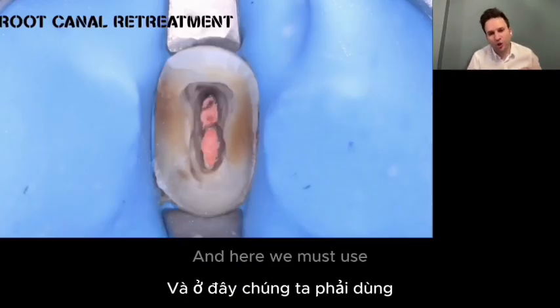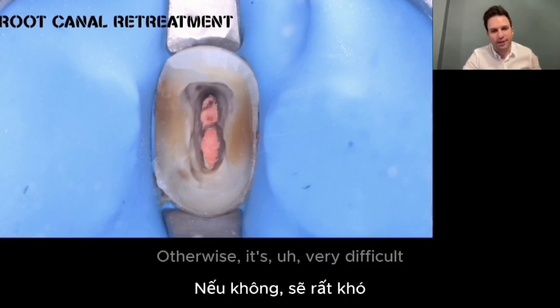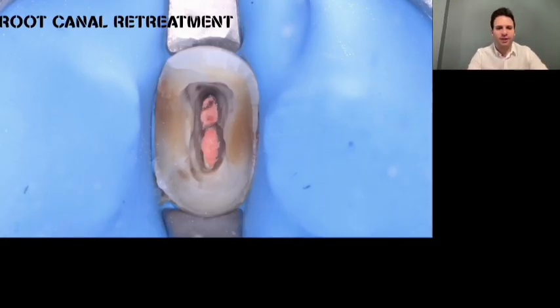Here we must use rubber dam application to isolate the tooth. Otherwise, it's very difficult to make a very dry area without bleeding.